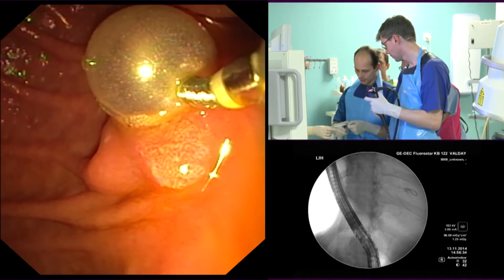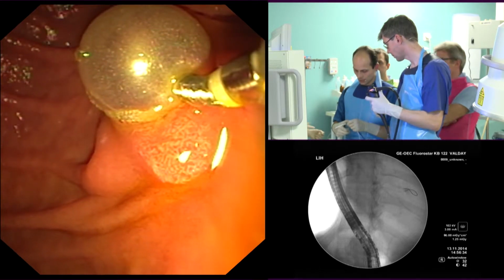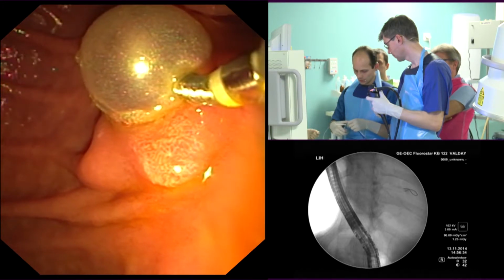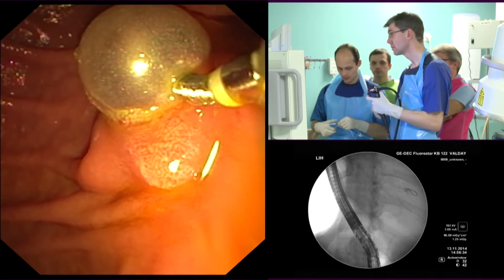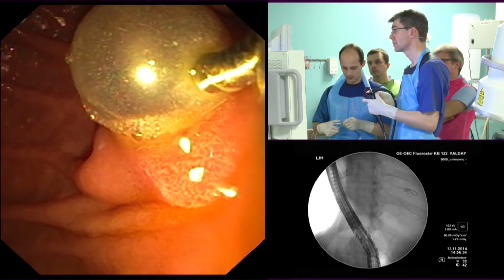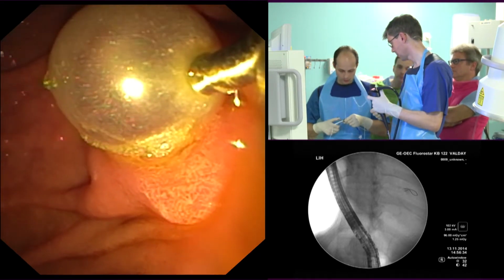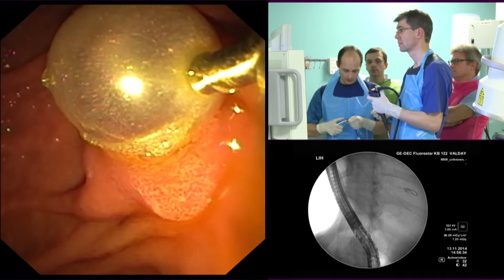Victor, if you give us 5-10 minutes, I think we will resolve this problem, and we will then contact you once again. To cut the guide wire.